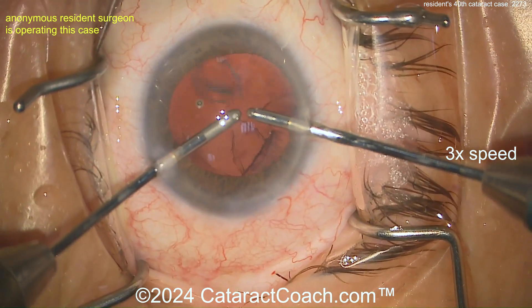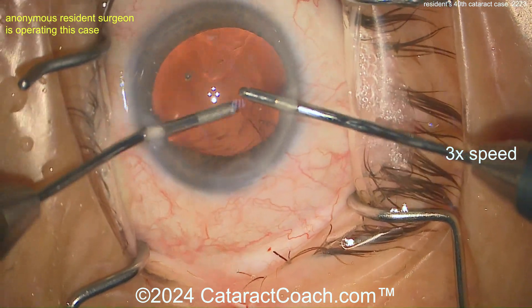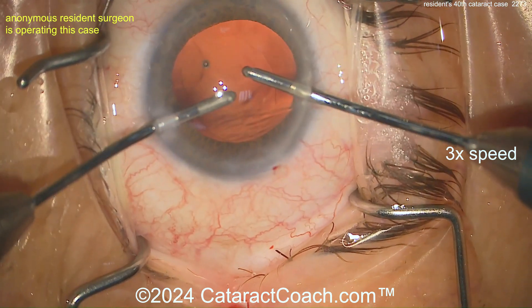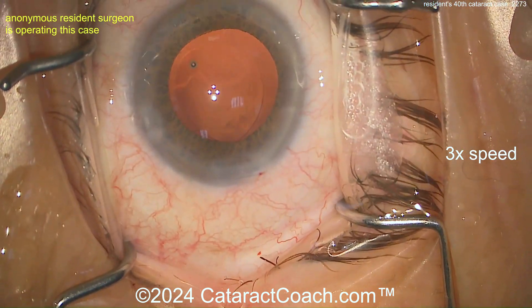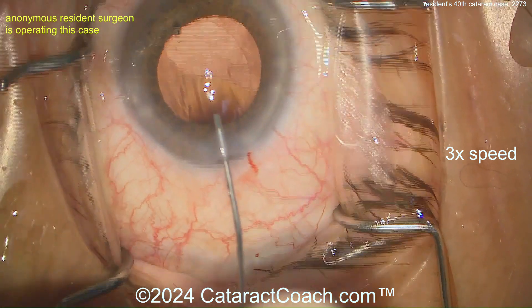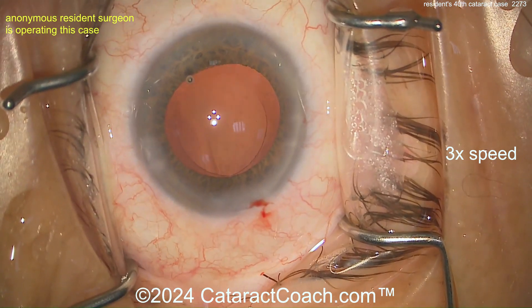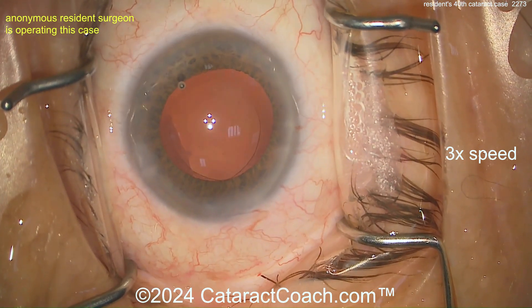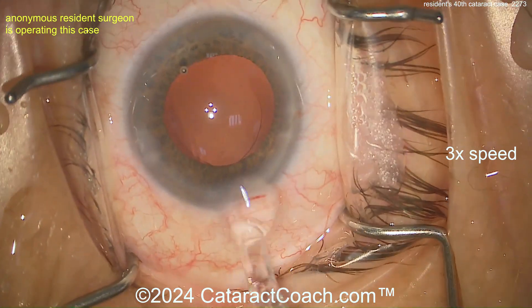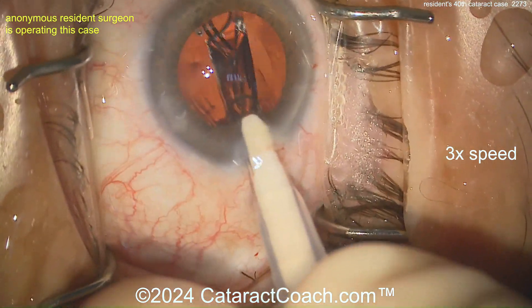For case 40, you're doing great. I really like the way you're operating. You've got the basics down pat — I like your draping, eye in primary position, how you float in the incisions, the main incision. The baby rhexis is not so hot — next time make a better rhexis. But that's not the limiting factor. Truth be told, maybe cataract coach is wrong — maybe that's a perfect rhexis — but I think it's just a little small.